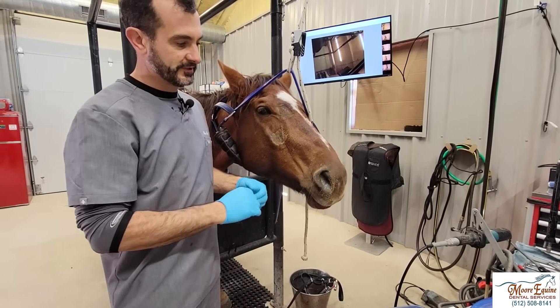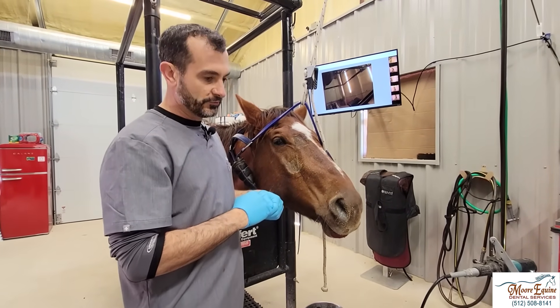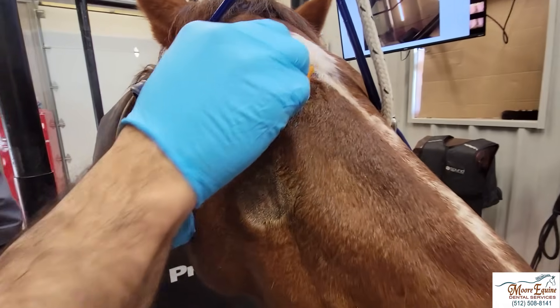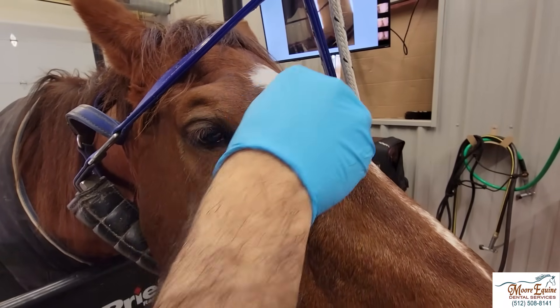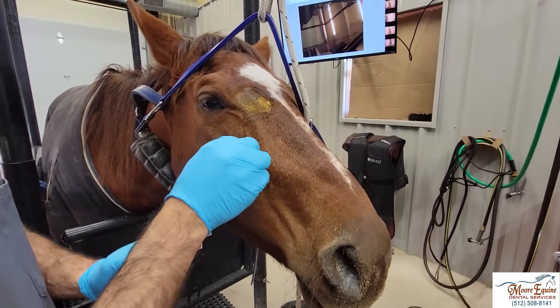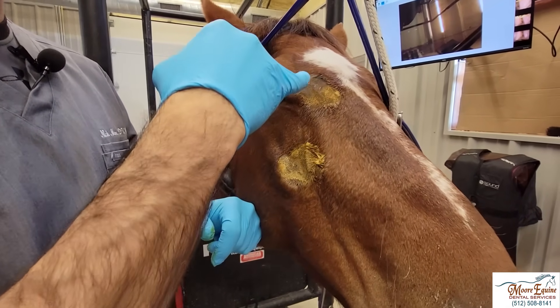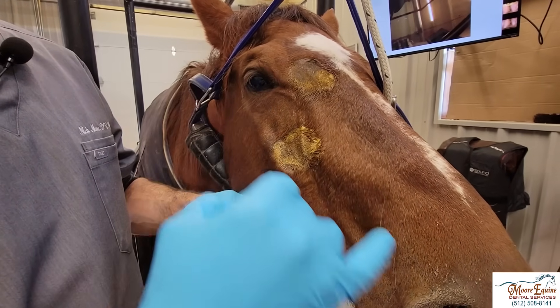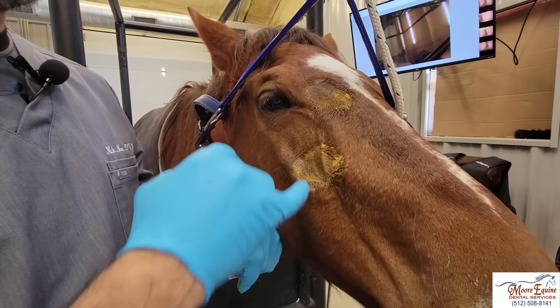This horse has a unilateral nasal discharge that we know is from a tooth. The alveolar socket is healing very well but we still have a little sinusitis. We're prepping right up here by the medial canthus, and then down just above the rostral aspect of the facial crest where we're going to go into the rostral maxillary sinus. Here we're going to go into the conchal frontal sinus, which connects to the caudal maxillary sinus — that drains out through the middle nasal meatus and out the nostril. Then we're going to lavage the rostral maxillary sinus.